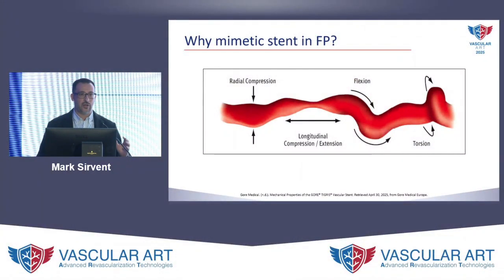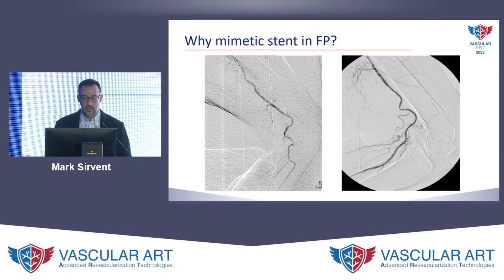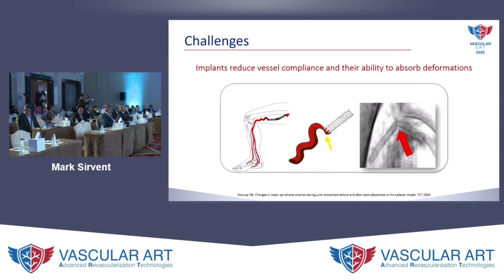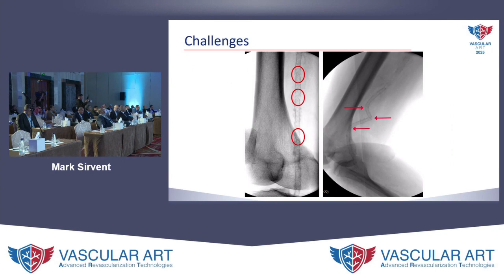Why mimetic stents in the FemPop? Well, you already know. The FemPop segment is a complex segment because many forces appear at the same time, especially in the popliteal area when the knee is flexed. And we can find this kind of issue, even fractures.